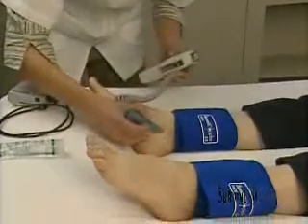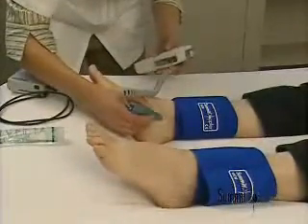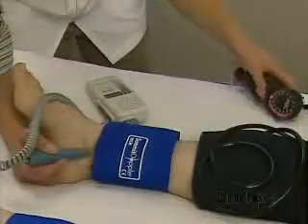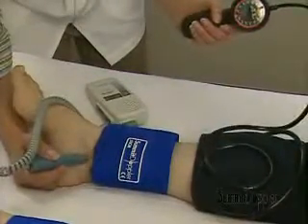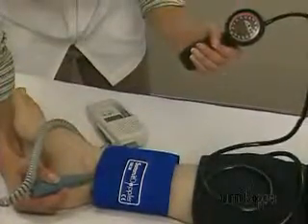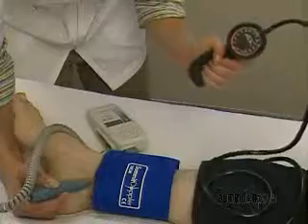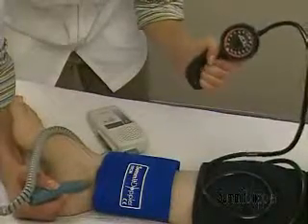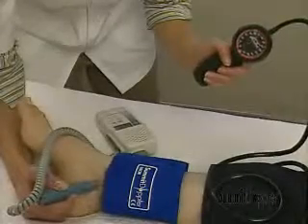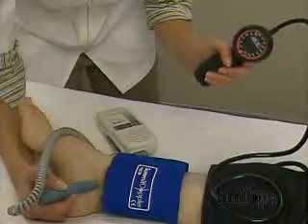After obtaining the Doppler waveform, proceed to take the systolic pressure at that ankle. Locate the vessel again and brace the hand to stabilize the probe. Inflate the cuff to about 20 millimeters of mercury above the occlusion pressure. If the Doppler probe comes off the vessel during inflation, deflate to 0 and try again. It may take a few times to learn the technique.